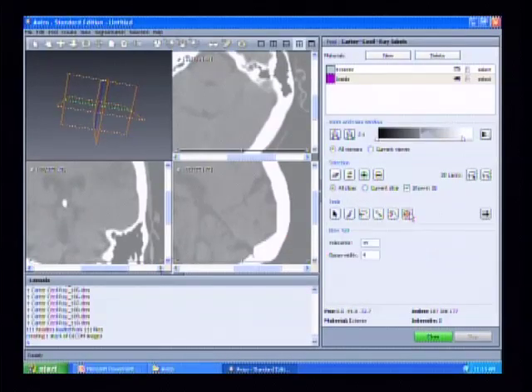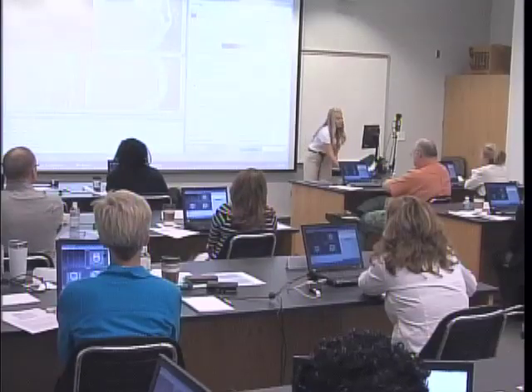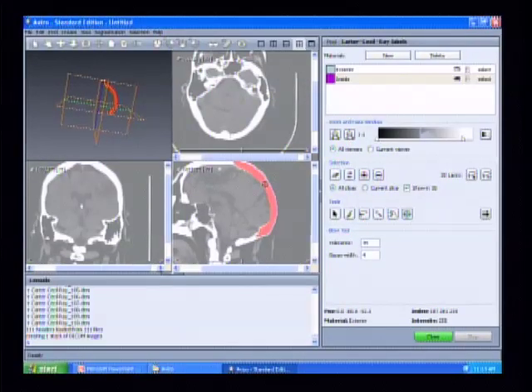And then the last tool that I think is useful is what they call the blow tool, which is the very last one. You can change the tolerance and the Gauss width, but we don't modify that much. What it'll do is you can start in the center of a selected range of pixels, and you can just press down and then reach out, and it will continue to grow. It'll do this region growing for a set of pixels that's within that same area.